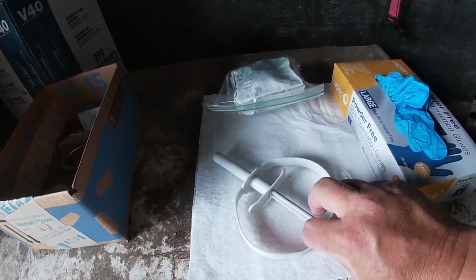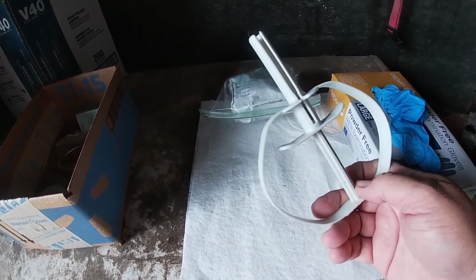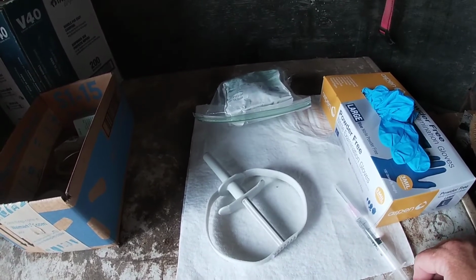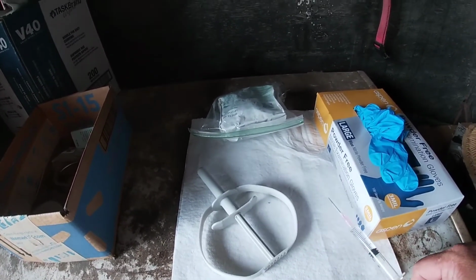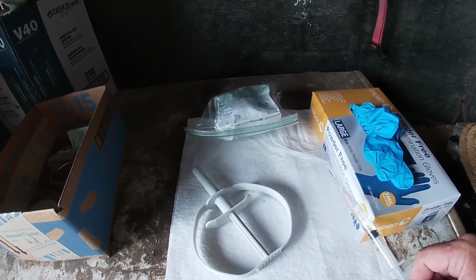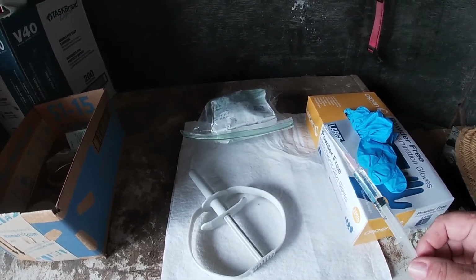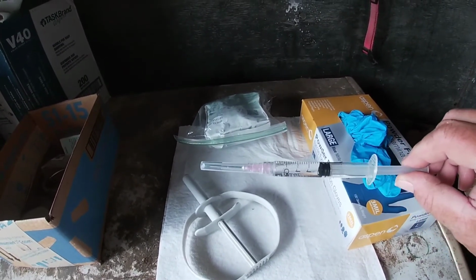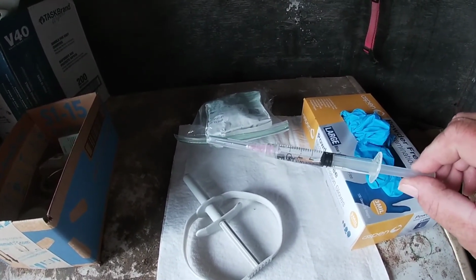You have to have an applicator to insert the CIDR. This particular doe, she's been with a buck. I don't believe she's bred because there's no signs of being bred. But I'm going to give her a shot of Estrumate just in case.